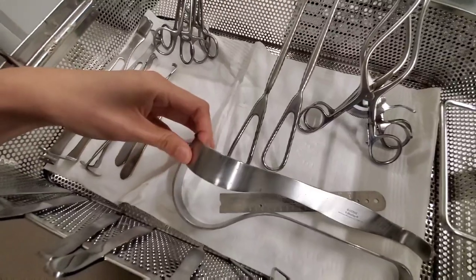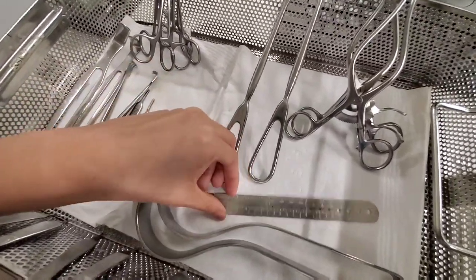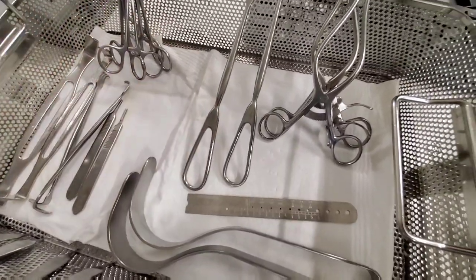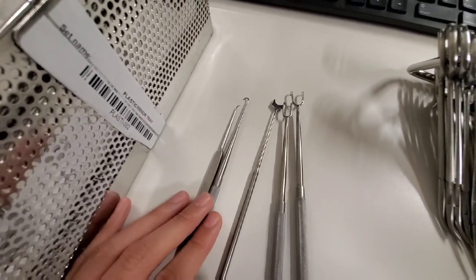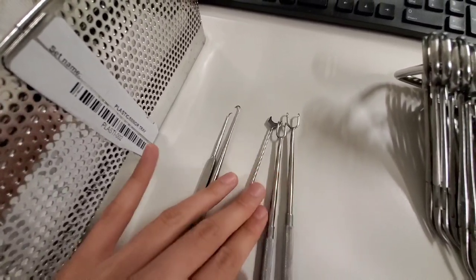You have these cute little Deavers and a silver ruler. These are single hook skin hooks, and these are double hook skin hooks.